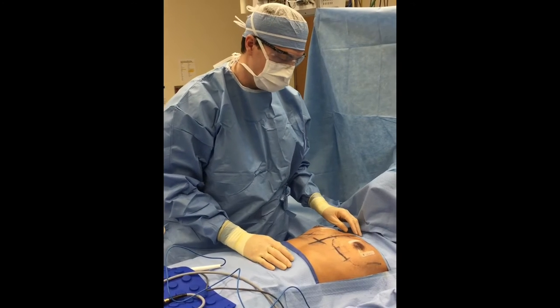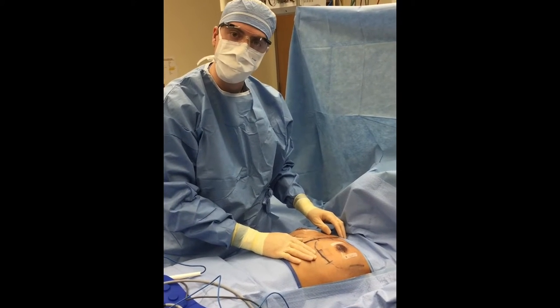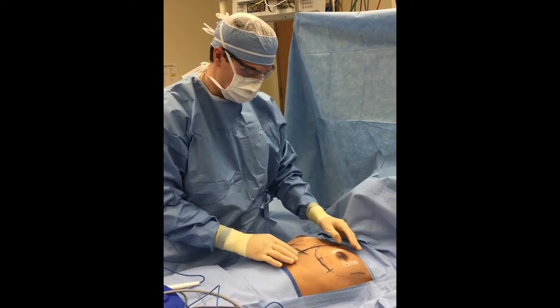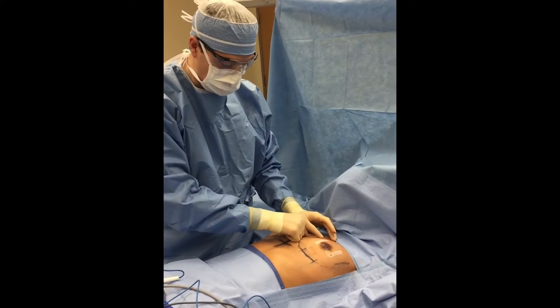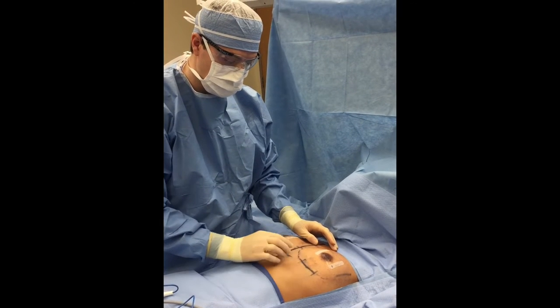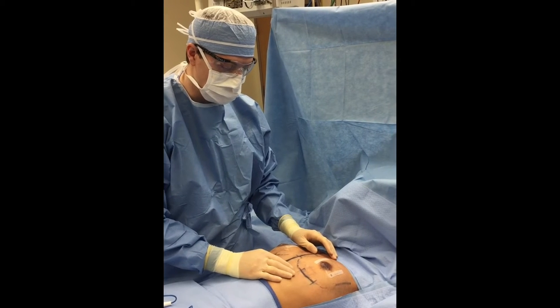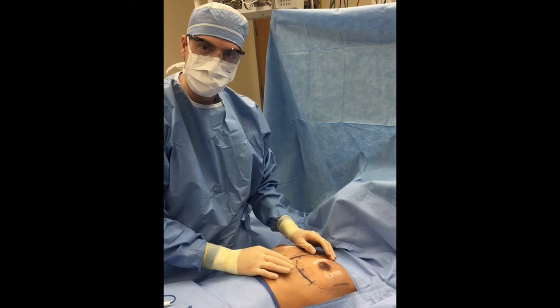This morning we have a breast augmentation. We have a nice young lady here that would like her breasts enlarged. She's a great candidate — as you can see, she's very symmetrical from side to side. We have our implants marked out where we're going to place them. We have what's called an inframammary fold incision here, and we're going to place a silicone implant under the muscle.